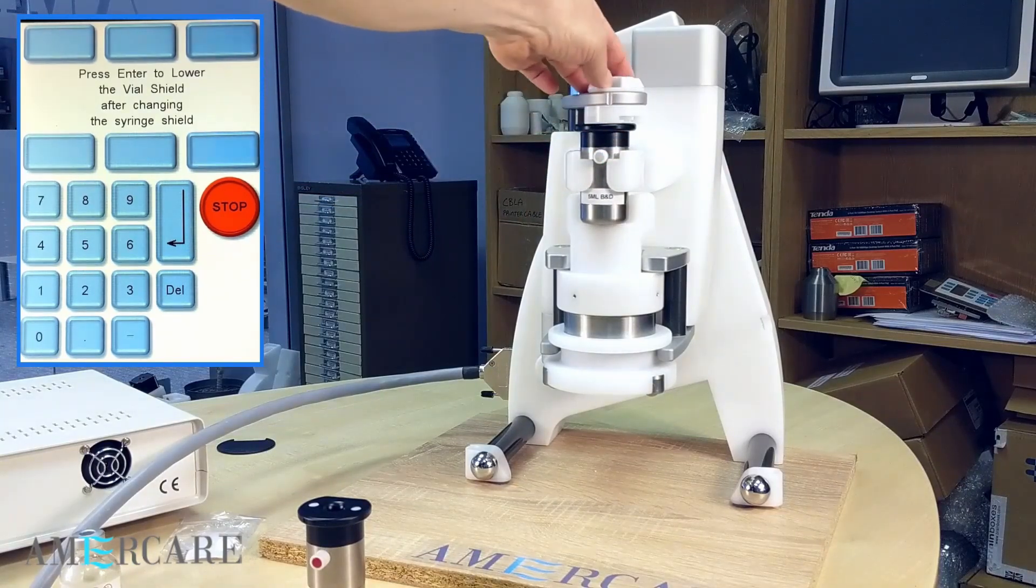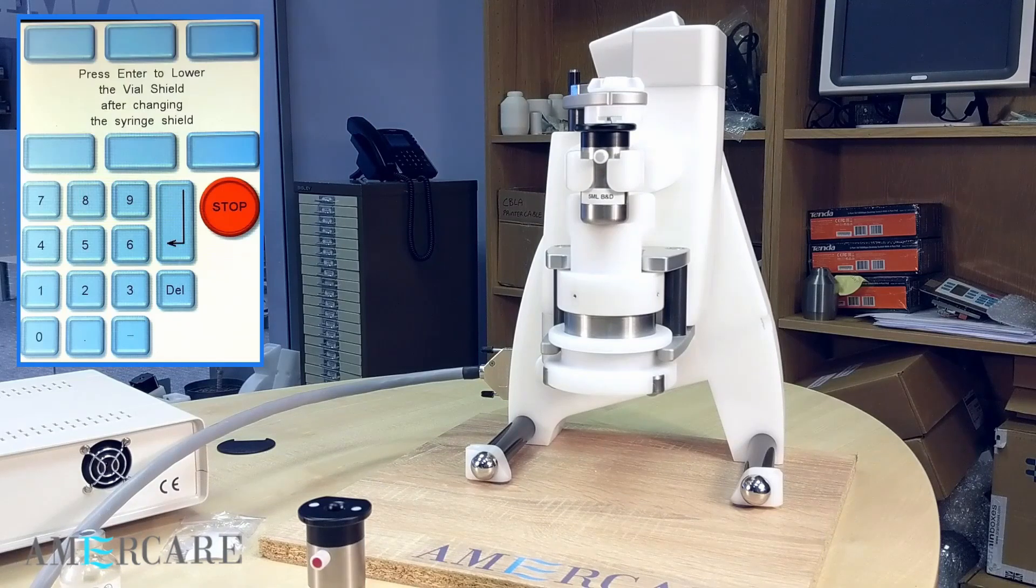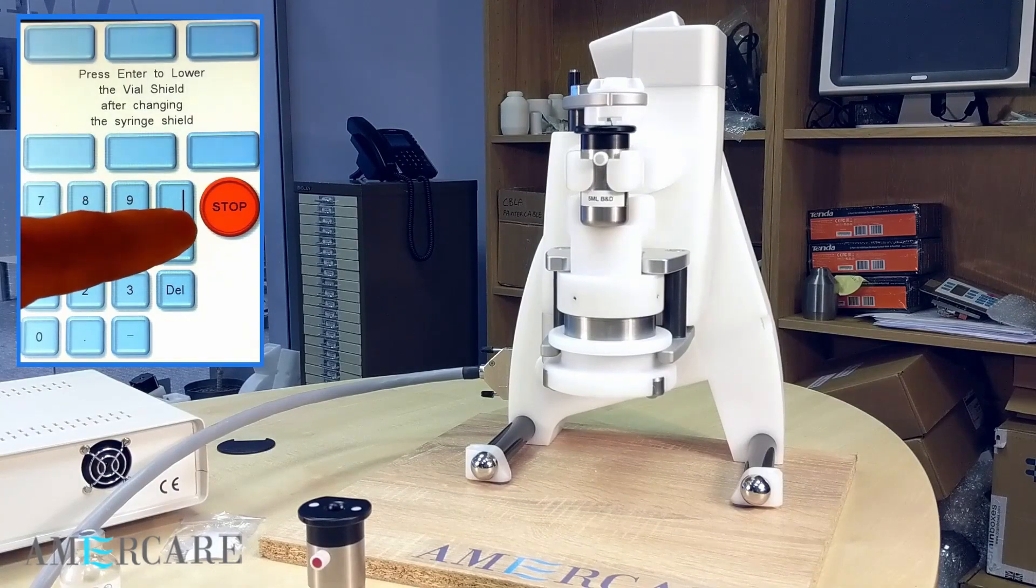Ensure that the dial on the top of the unit matches the colour of the cap of the shield. Press enter to lower the carriage.